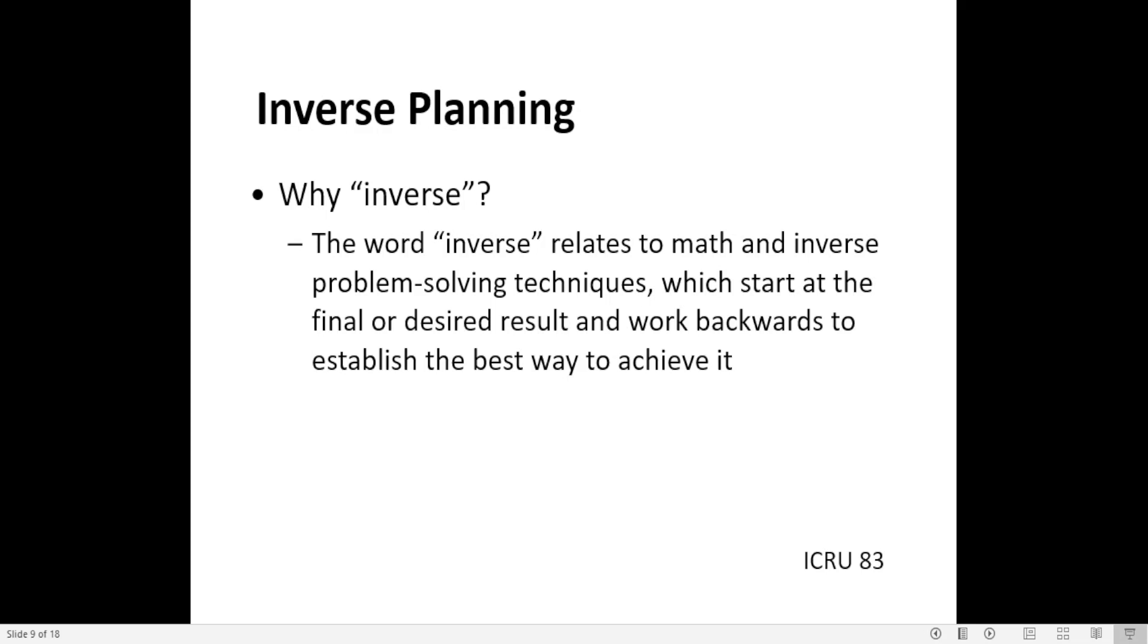So in inverse planning, in IMRT inverse planning, we set the goals, the dose distributions we want at the end when the optimizer is done. So we have the final or desired result there and let the optimizer do the work to get the best way to achieve it.